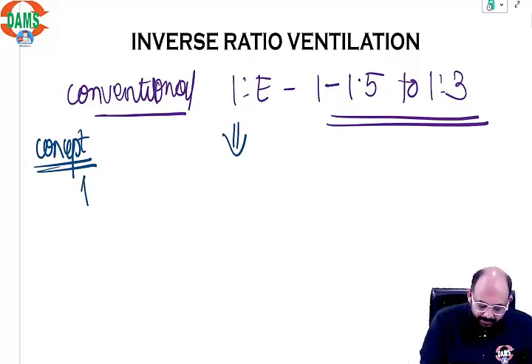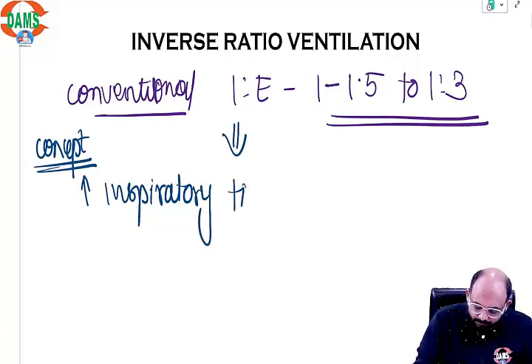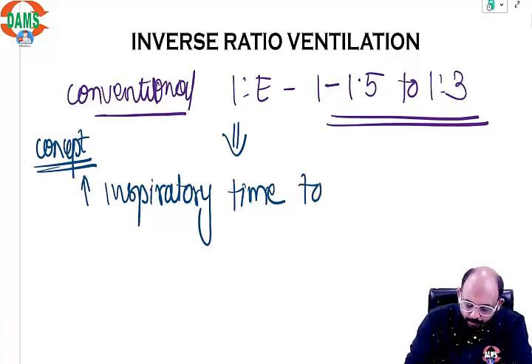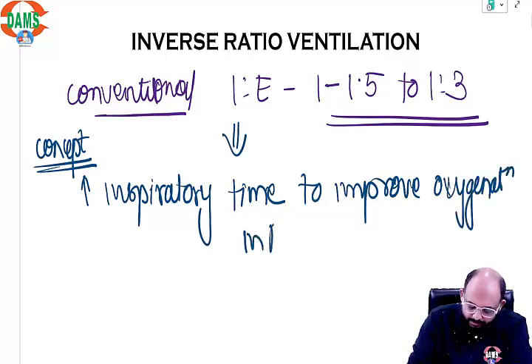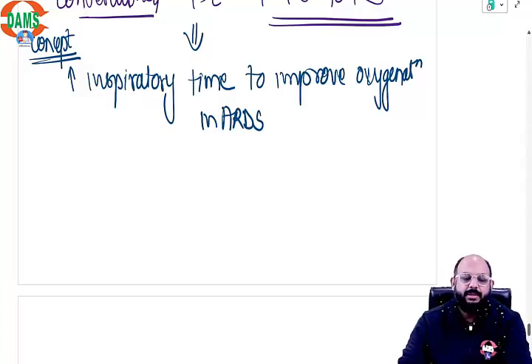The concept is to increase the inspiratory time to improve oxygenation in ARDS.